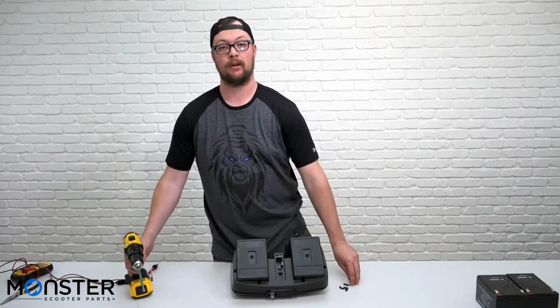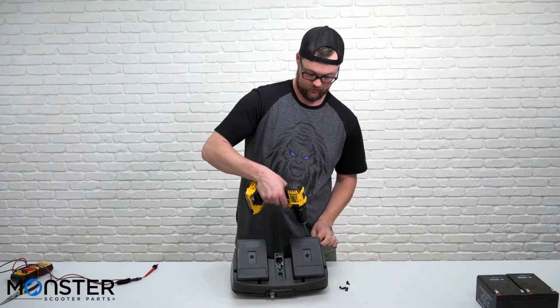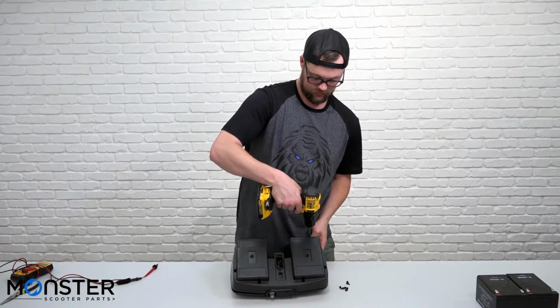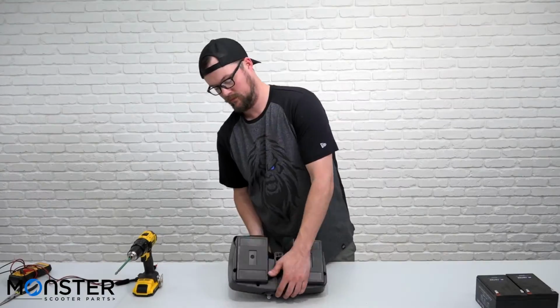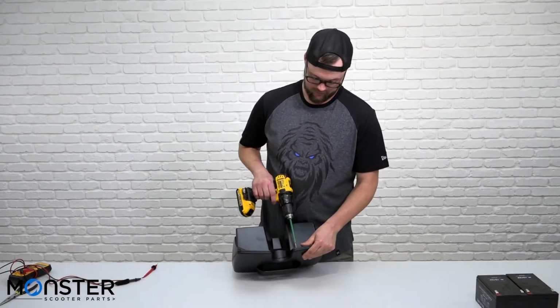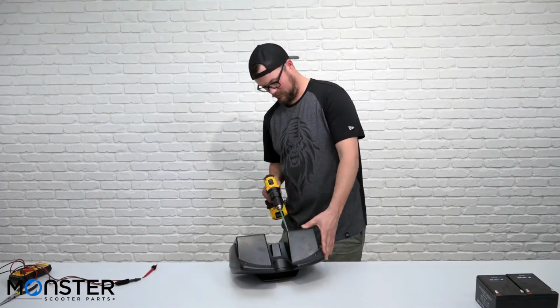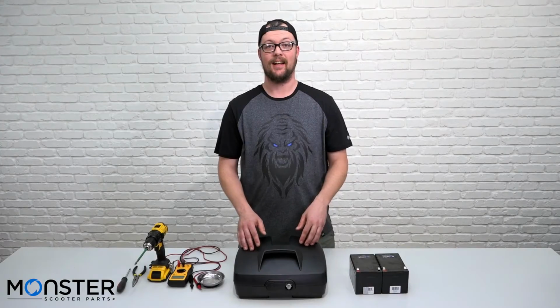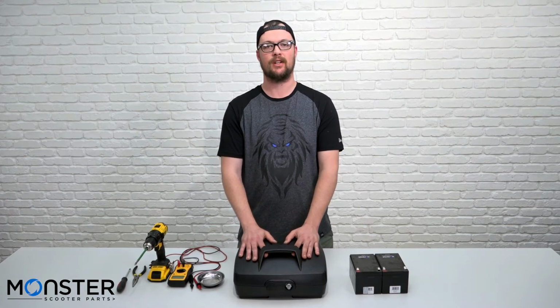Now we'll start putting our battery box back together with our 8 Phillips head screws. And now you know how to replace the batteries in your standard capacity GoGo Elite Traveler battery box.